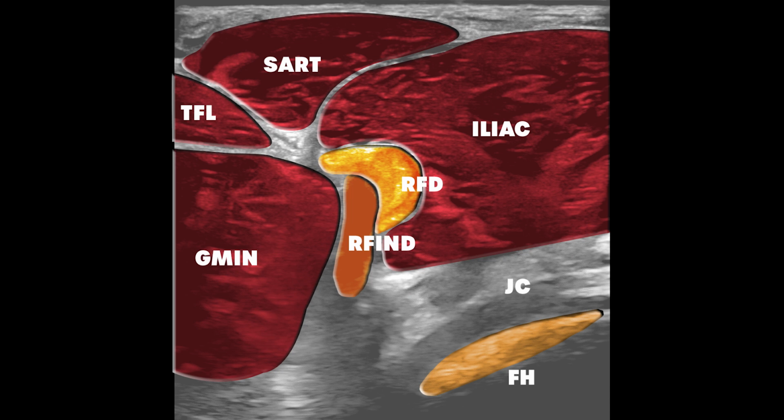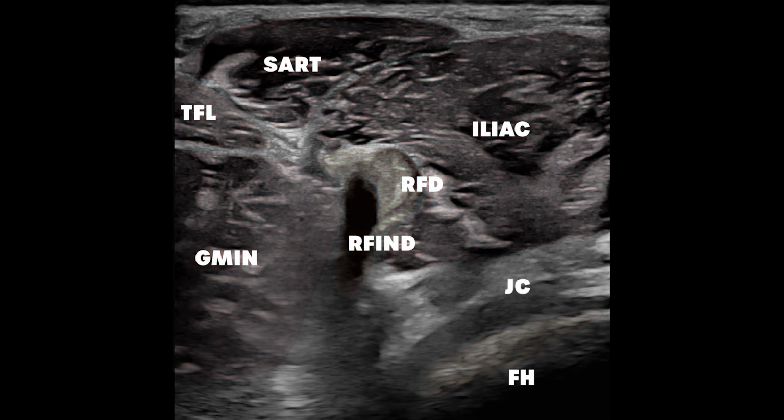To better visualize the anisotropic portions of the indirect tendon, the ultrasound probe must be shifted laterally. This maneuver ensures that the indirect tendon is once again visualized orthogonally. The indirect tendon is then examined from the lateral side of the thigh and followed proximally to its insertion at the acetabulum. Watch how the probe is shifted laterally and at the same time orientated parallel to the indirect tendon. The tendon stays anisotropic until scanned exactly orthogonally.